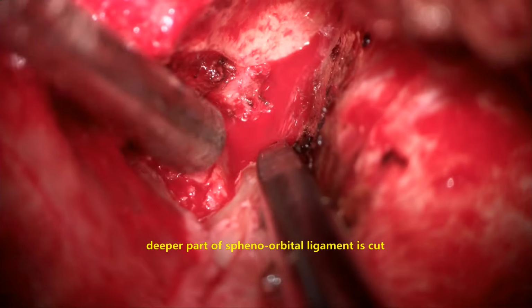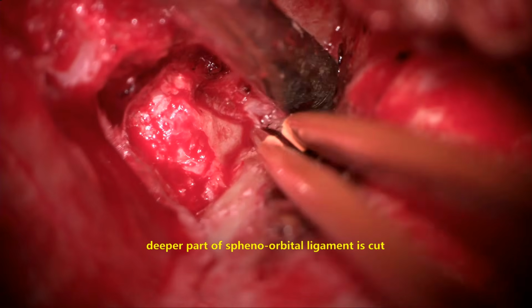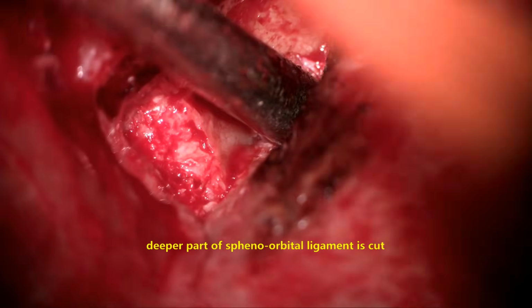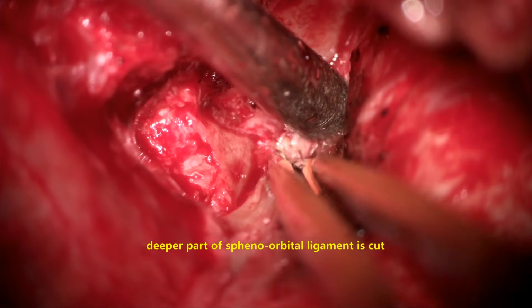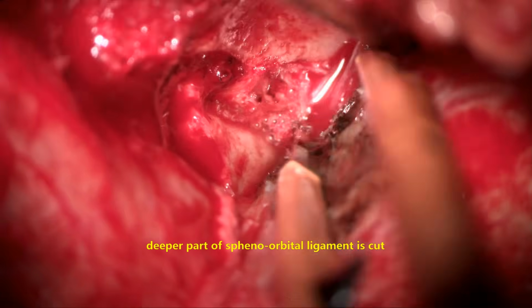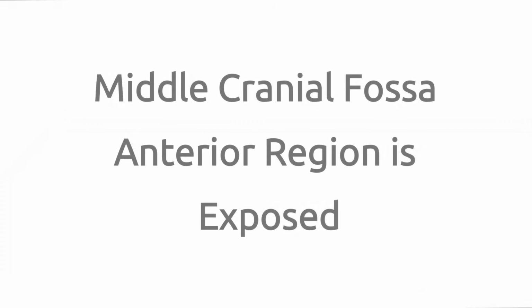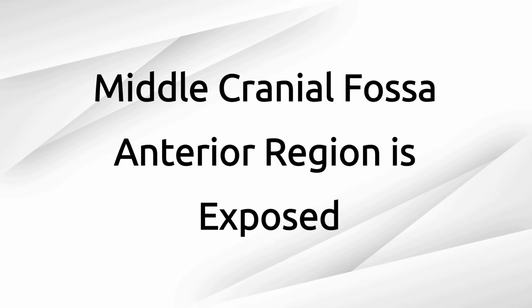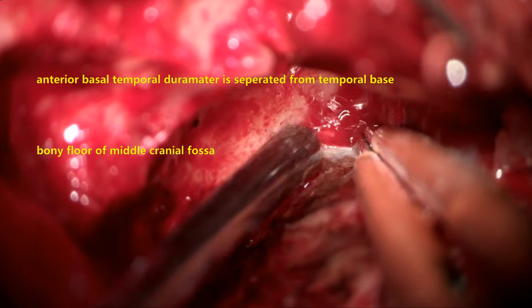Now you can see that after cutting the deeper part of the sphenoorbital ligament, we have reached the middle cranial fossa floor, and that is the basal dura of the middle cranial fossa, which is gently being peeled away. Once the deeper part of the sphenoorbital ligament is cut, the basal dura will be easily separated.